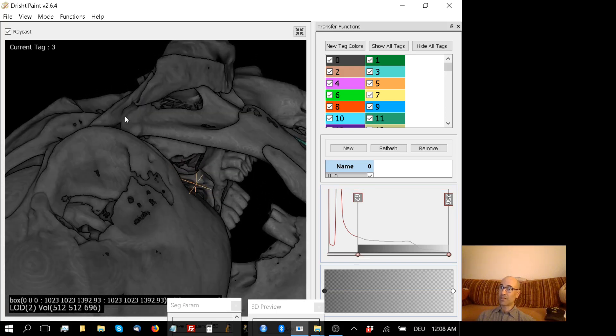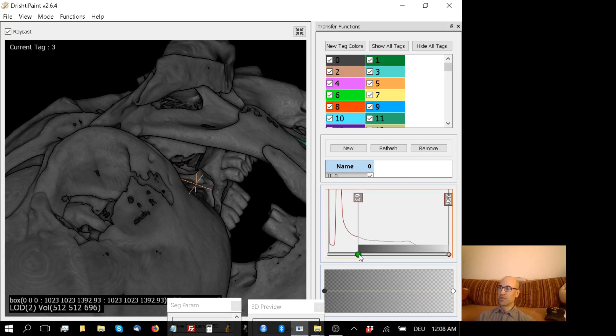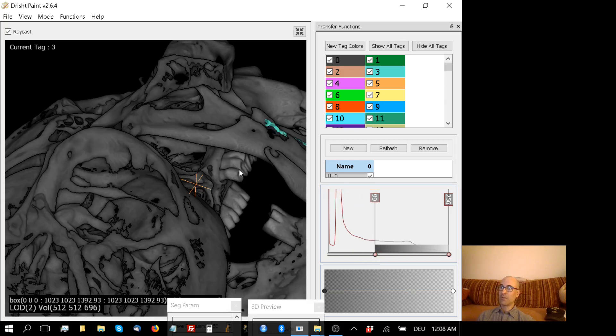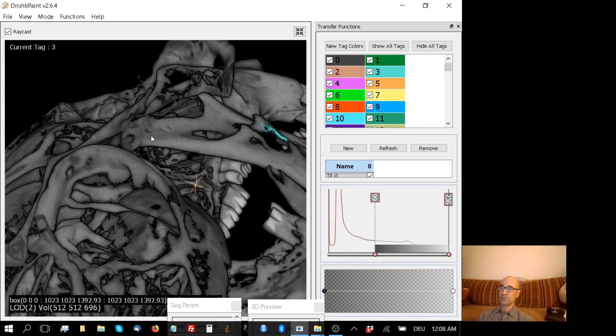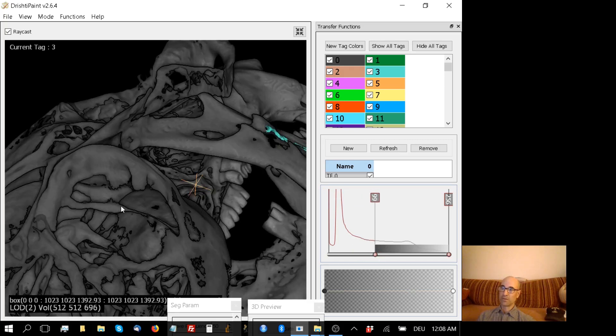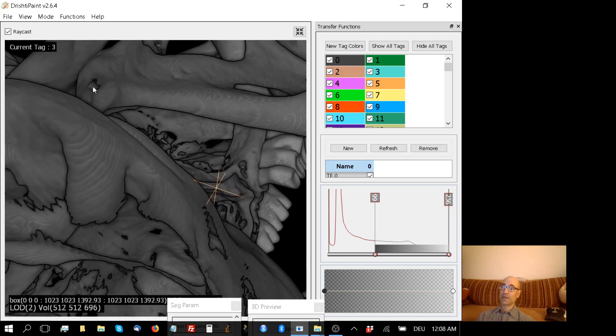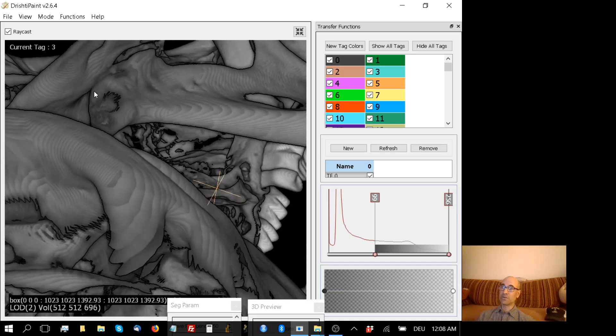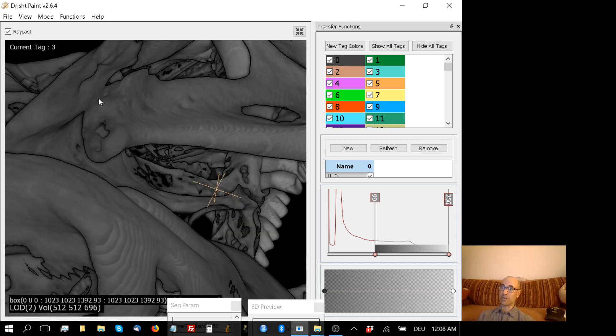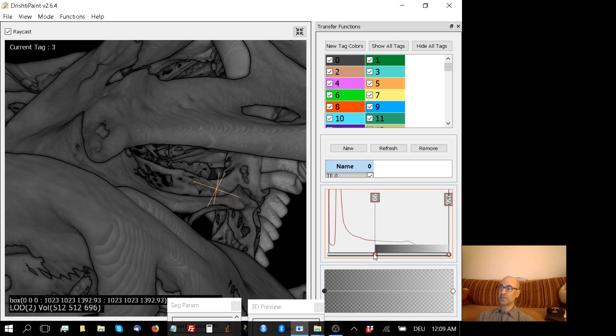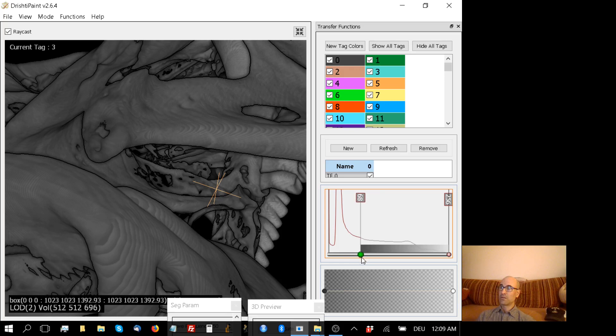One way is to manipulate the transfer function even more. If you're really lucky, that's a very thin bone, which it actually isn't in this case, but I'll just show you. If I move the transfer function in the lower end up a bit, you see a lot of the bone will disappear because it's very thin, it's not very dense. But that connection here in the jaw is still there. So unfortunately I can't use that as a shortcut to tag the lower jaw 3.